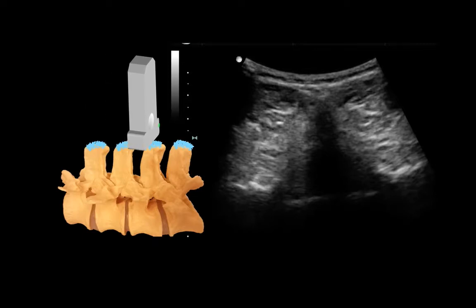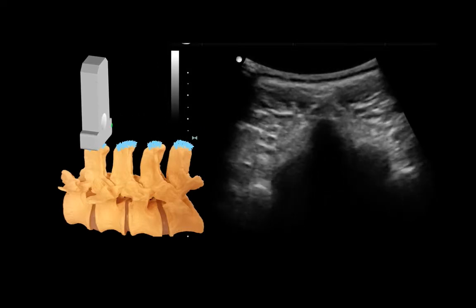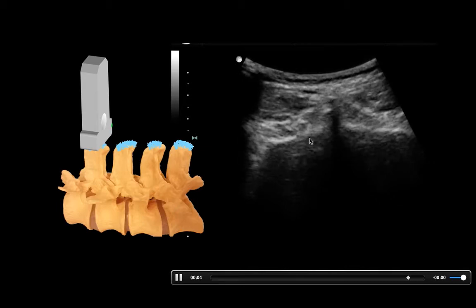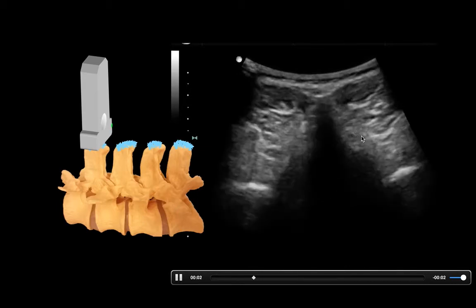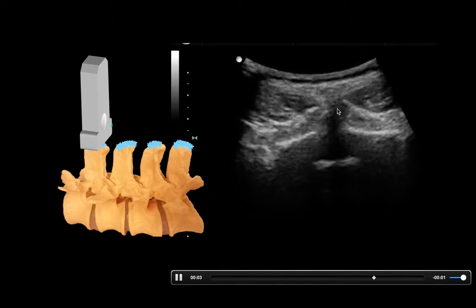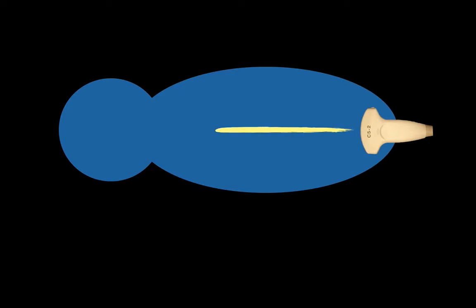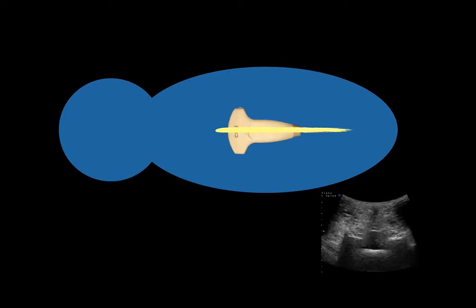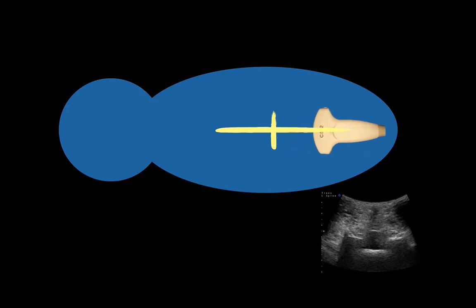Here's a clip of what that might look like in real time as you scan up and down the patient's spine — you get the spinous processes there, and then moving into the sacrum as you scan more distally, then going back up again to where the spinous processes are. Using ultrasound to help you landmark where midline is, I tend to mark that. Then I usually scan down until I find an area where the hypoechoic shadowing is not as dramatic, which tells me I'm likely in between two spinous processes, and at those sites I'll make a mark for my needle entry.